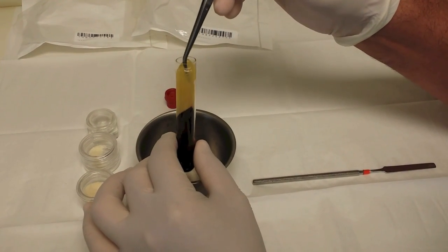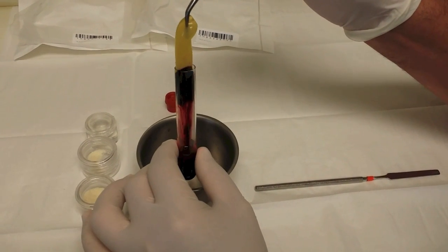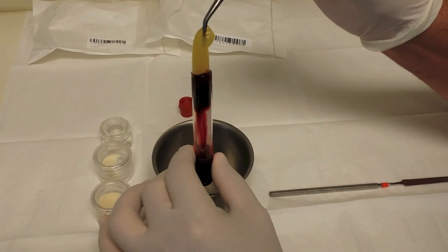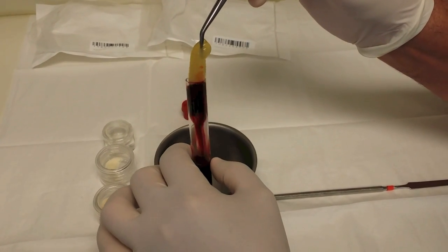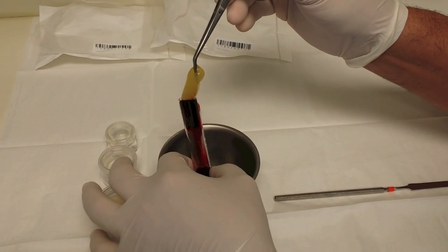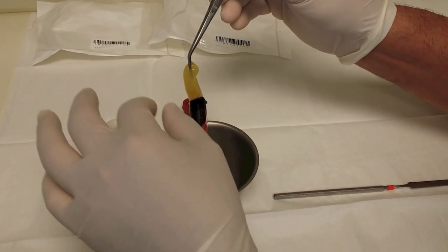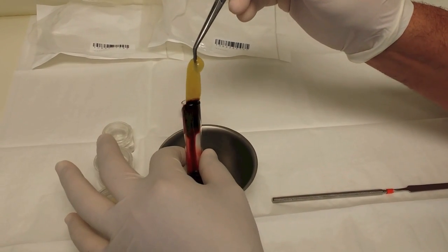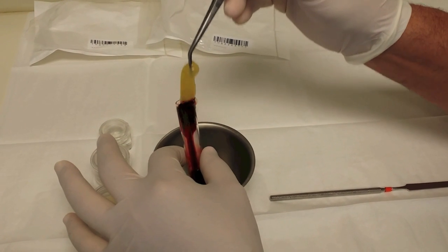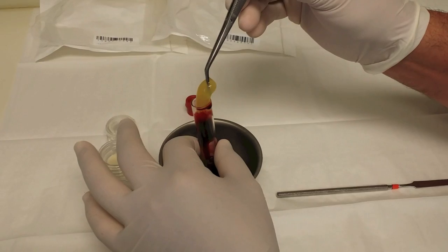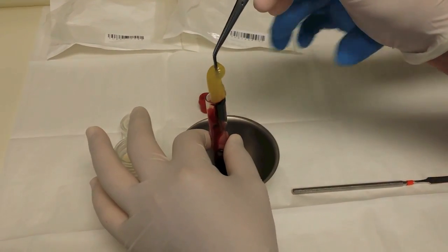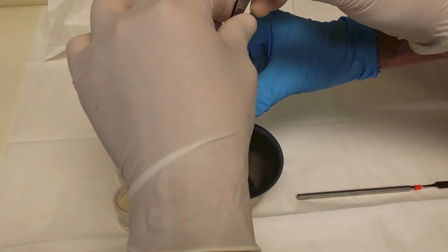So here comes this snot clot. You can just basically grab it like this. It doesn't matter if that little blood gets everywhere, it's not a big deal because we're not going to need it. But George do me a favor, grab the little vial right there, hold that right there, perfect.